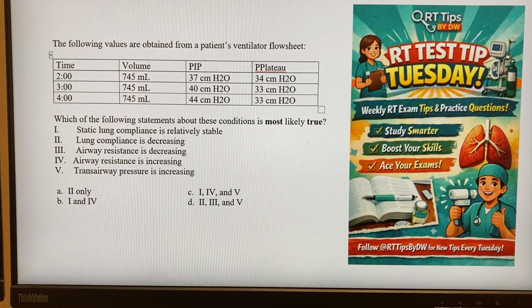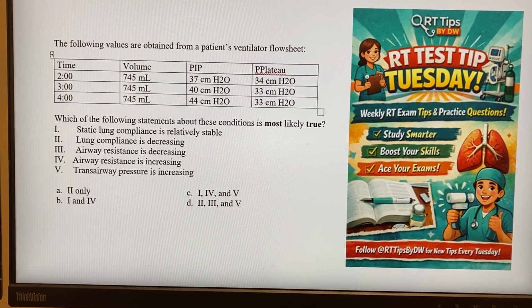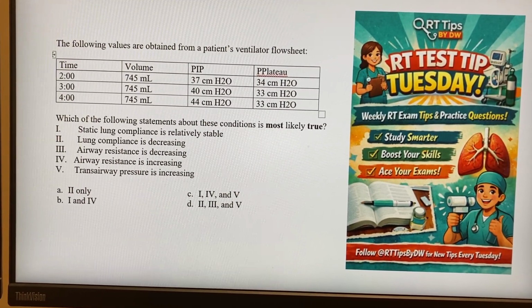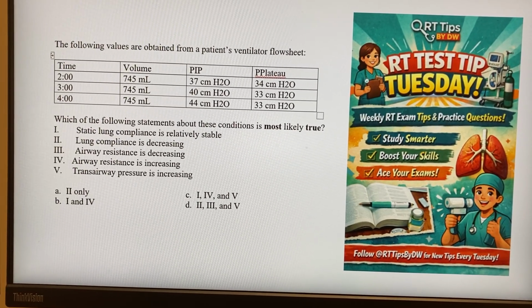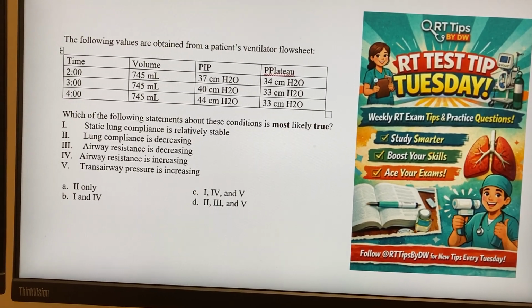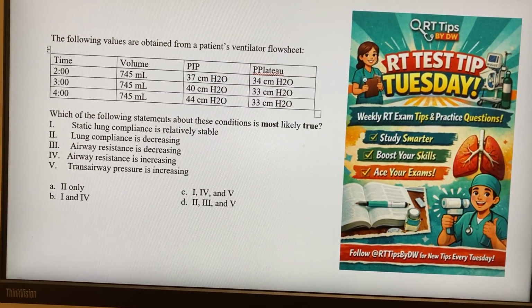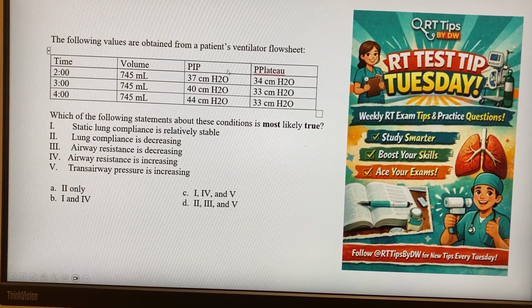And you've also got to remember about the plateau pressure, how do you achieve it? Well, you've got to have an inspiratory hold maneuver done on the ventilator in order to achieve said plateau pressure, unless there's a time pause built in, but typically we don't breathe like that. So you're going to achieve your plateau pressure when you do an inspiratory hold maneuver for the patient by pressing the inspiratory hold button on the ventilator, or having the ventilator perform that maneuver, and then that'll give you your plateau pressure.